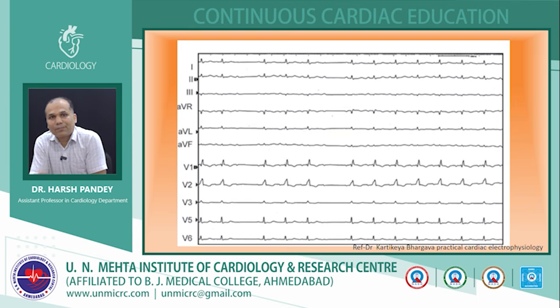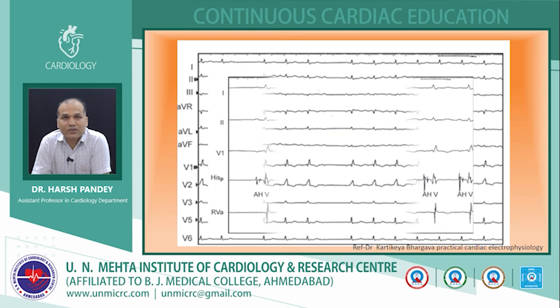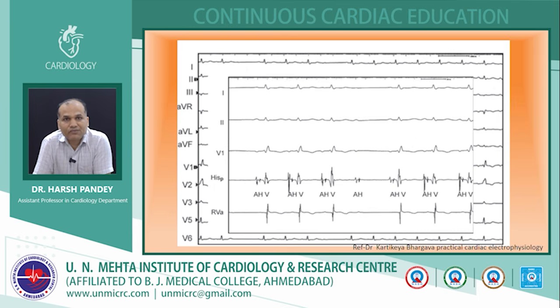So this is one of the examples. Some P waves are blocked here. The patient underwent an EP study, and they found that the block was at the infra-AV nodal level. A to H came, but V did not come.